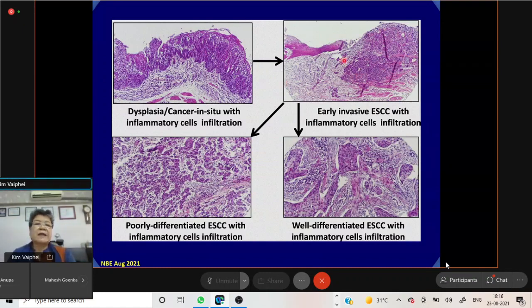This kind of reporting in a given biopsy is very important with the advancement of submucosal resection, which is a practice in many advanced centers where there are capable gastroenterologists. And so I think identifying this extent of involvement, the type of the dysplasia, and also whether it is carcinoma in situ or early invasion into the lamina propria, up to the muscularis mucosae and the early or superficial part of the submucosa, are very important factors to be commented upon.